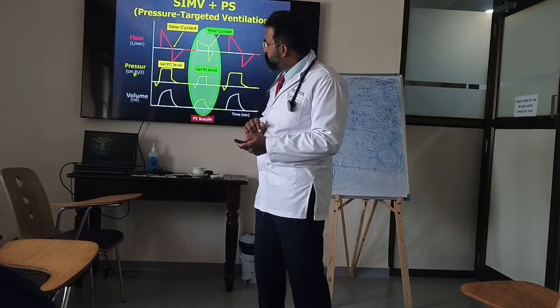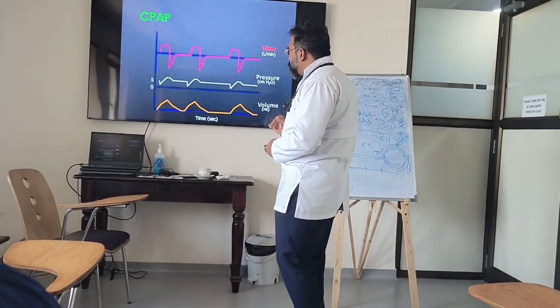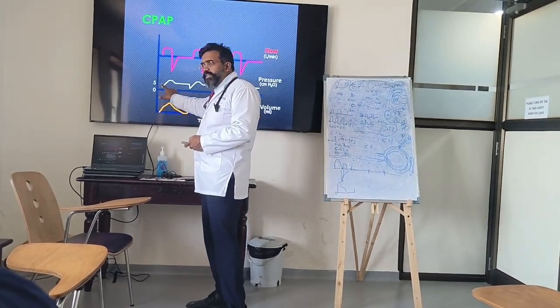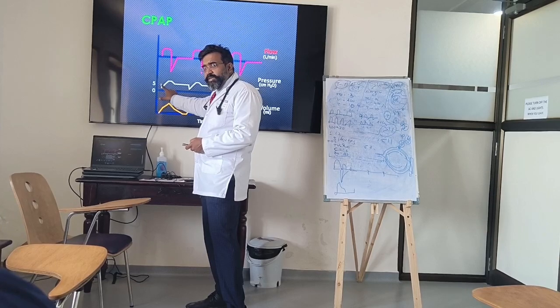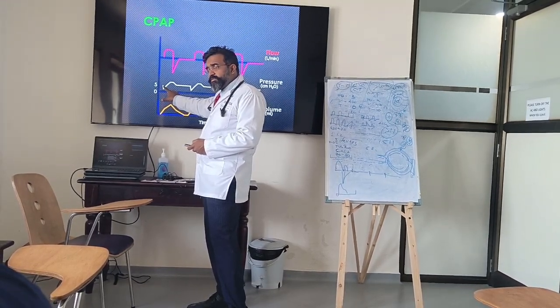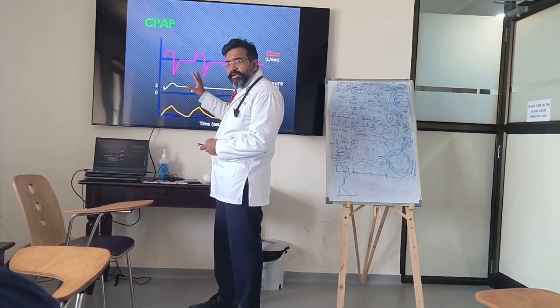Clear? All right. So what is this now? If you look at this, trigger is what? Patient. You can see some deflection that is occurring. Patient trigger. What is the limit? Patient is deciding the limit.